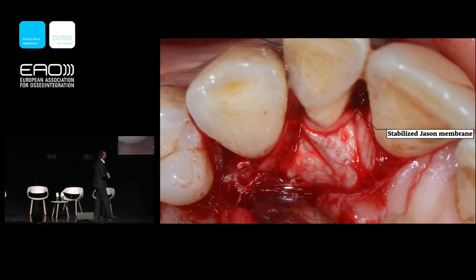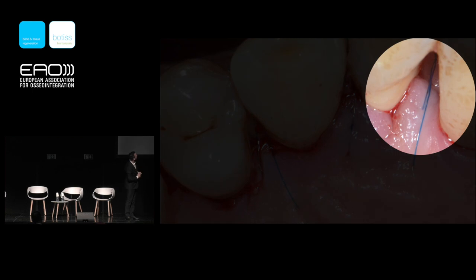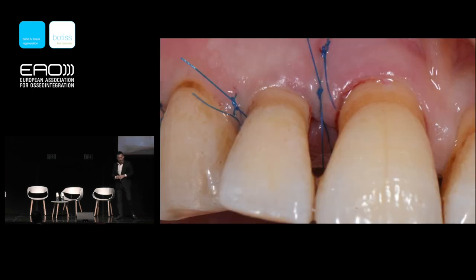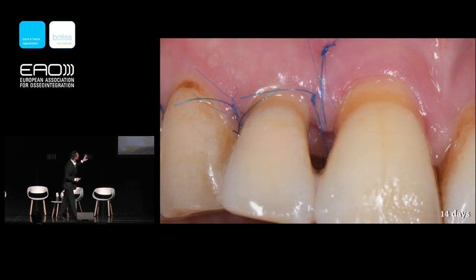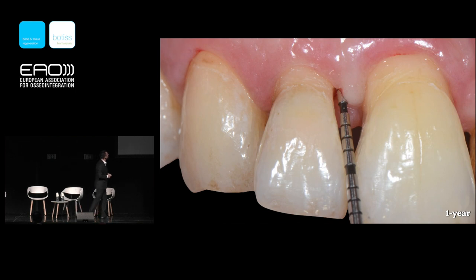From the principles of GTR published in 1982 by Nyman, we need to stabilize a collagen membrane — a Jason membrane for this case. I tightly adapt the membrane over the neck of the tooth like a scarf, then close the flap. The most important part is the closure of the defect-associated papilla. Immediately after surgery and at two weeks healing, you can see the incision line is primarily closed.